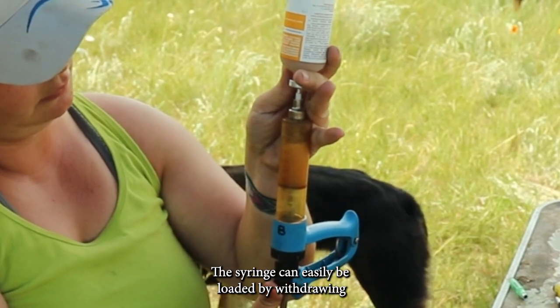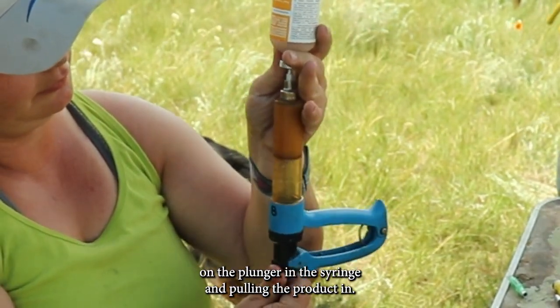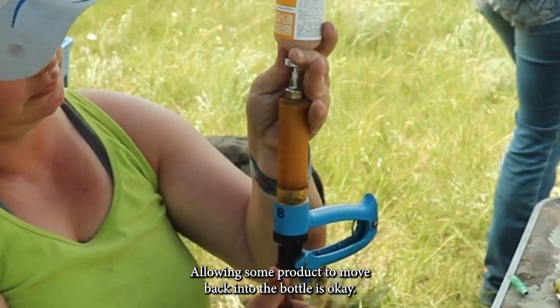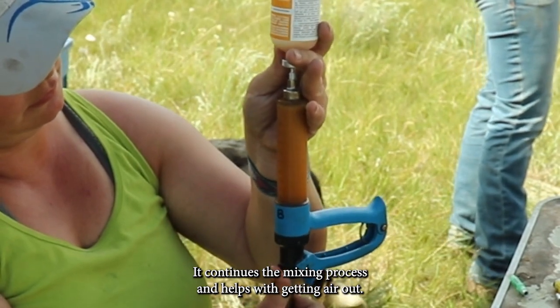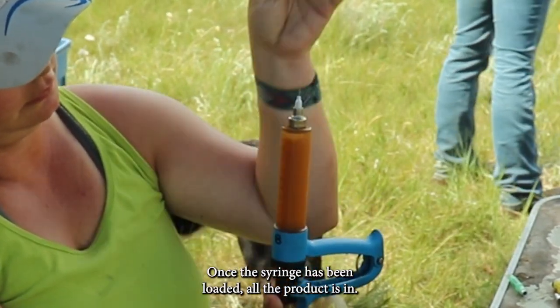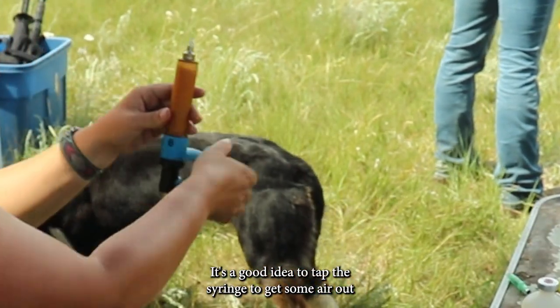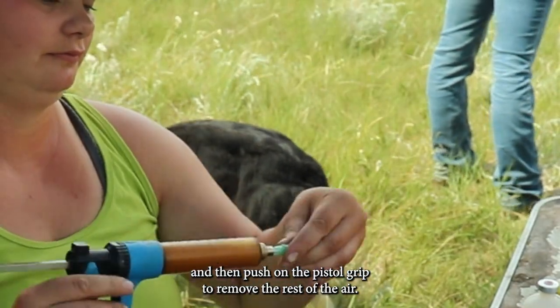The syringe can easily be loaded by withdrawing on the plunger and pulling the product in. Allowing some product to move back into the bottle is okay — it continues the mixing process and helps with getting air out. Once the syringe has been loaded, it's a good idea to tap the syringe to get some air out and then push on the pistol grip to remove the rest of the air.